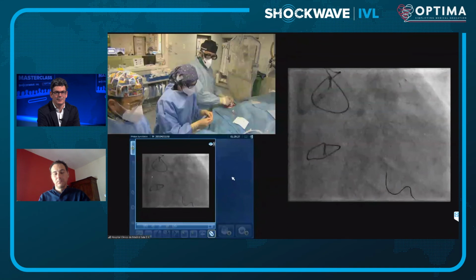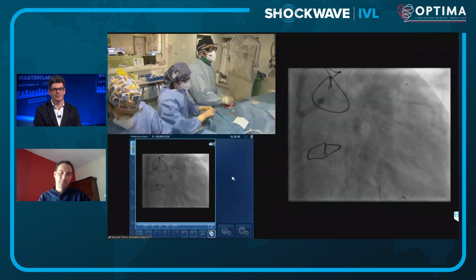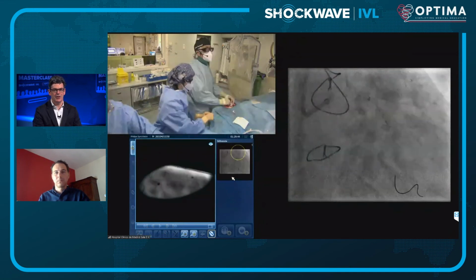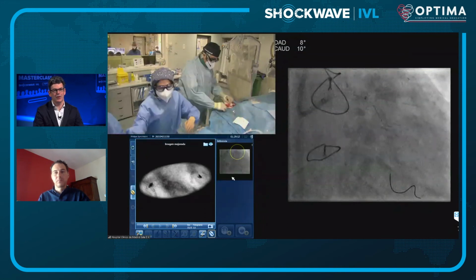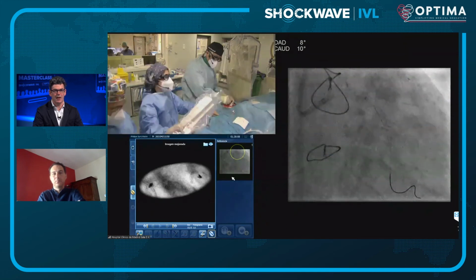So we just had a mild attempt using a guiding catheter extension just to support the OCT to advance because it was a difficulty. So it advances very nicely. Is this to help with the angulation or is it just the positioning since the stent has gone in? No, simply because the OCT is often an issue going into the angulation of a circumflex, especially where there's rigidity from calcium, and there may be one or two little spicules of calcium projecting out into the lumen. So it may impinge on the OCT catheter.